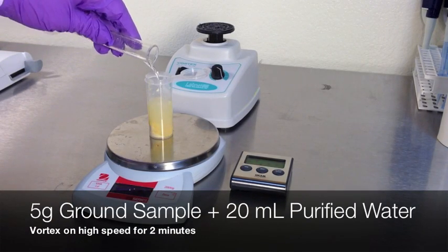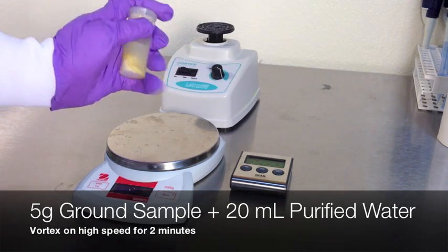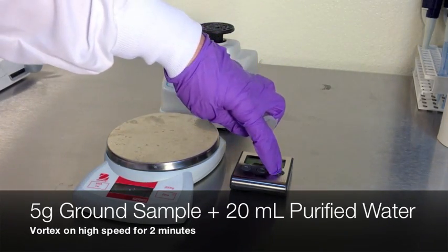Add 5 grams of ground sample and 20 milliliters of purified water to a disposable extraction tube. Close the lid and vortex on high for 2 minutes.